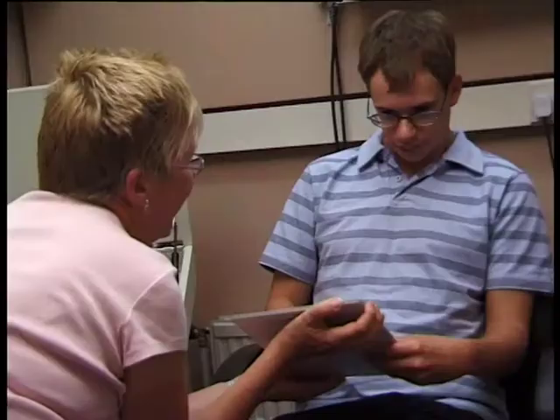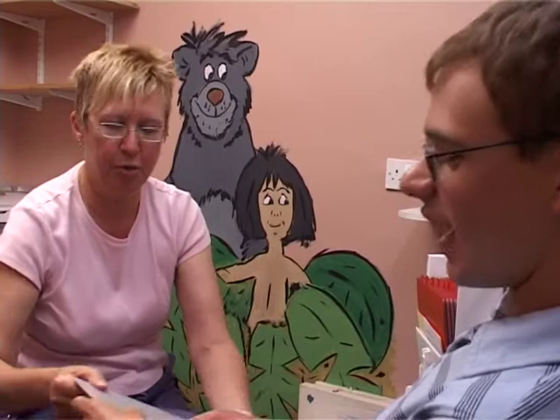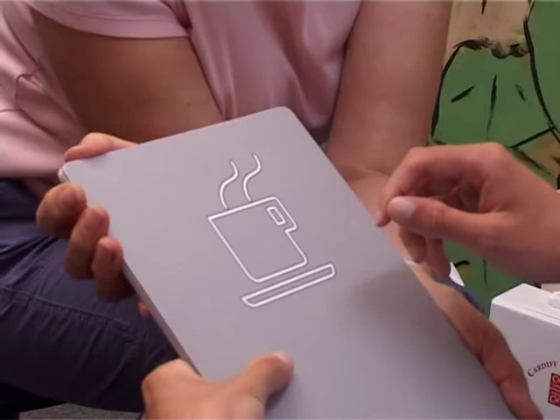Although the test is designed for preferential looking, we can use it in different ways. This is Jonathan — because of his cerebral palsy, Jonathan doesn't have reliable eye movements and he's not able to reliably look at the pictures. So I can't use his eye movements to judge whether he can see the picture or not. For Jonathan, we use pointing instead.